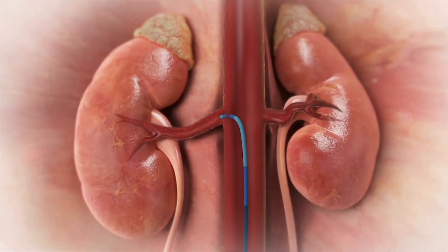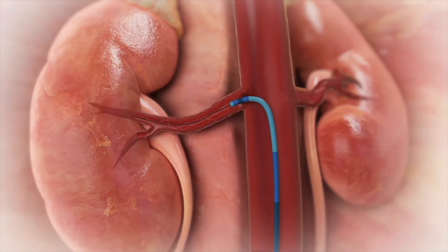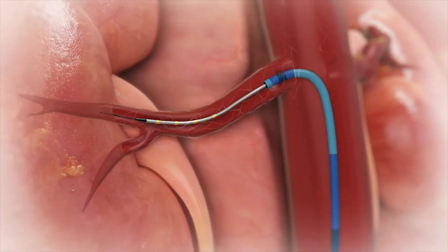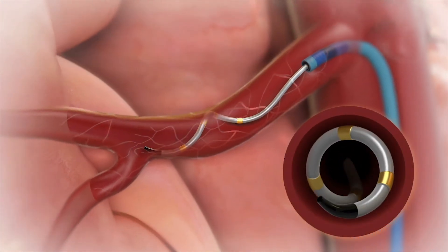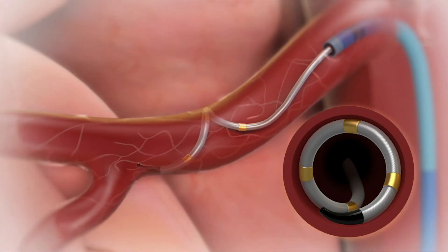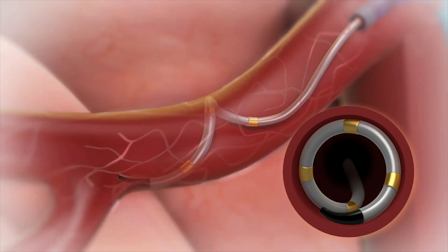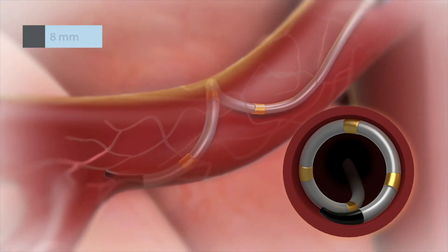The Simplicity Spiral catheter is a 6 French compatible catheter that is delivered using a rapid exchange system with a standard .014 guide wire. When the guide wire is retracted, the Simplicity Spiral catheter naturally conforms to the patient's renal artery without occluding blood flow. It is capable of treating a wide range of arteries as small as 3 mm in diameter and as large as 8 mm.